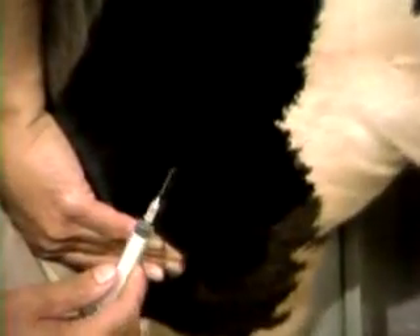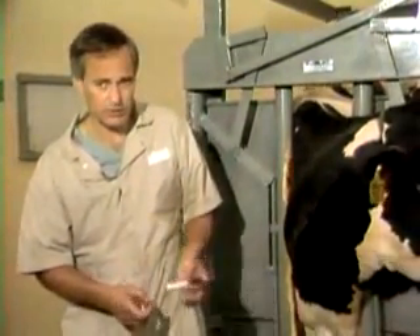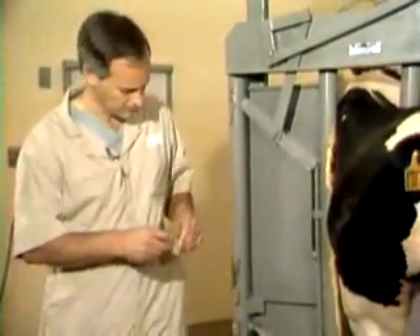In taking the blood sample, you can simply take a small gauge needle, go right directly over the vein, and quickly thrust it right into the cow's vessel and pull out the sample that you want. Then you can put it into whatever tubes are appropriate for the test you're running. Make sure you get it out of the syringe as quickly as possible so that you don't end up with a clot that you can't retrieve.